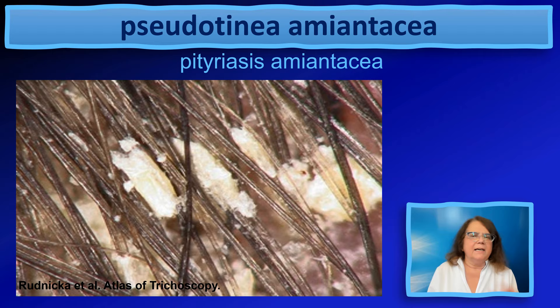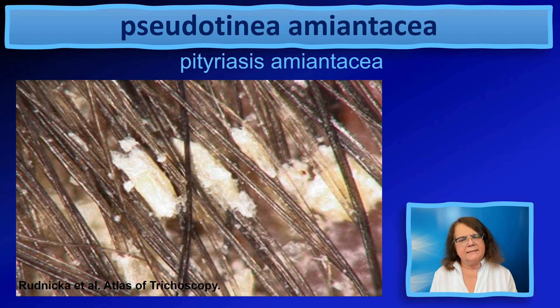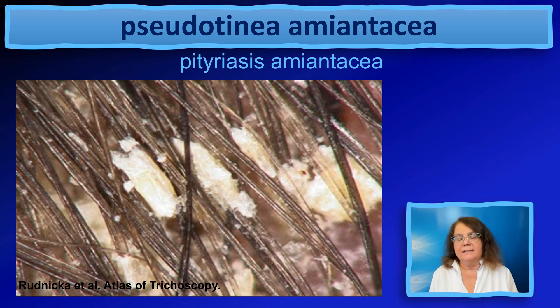Pseudotinia amiantacea may be a manifestation of many diseases, including psoriasis. Here you see the typical trichoscopy image of pseudotinia amiantacea with the typical multiple hair casts. Again, just to repeat: this is not typical of psoriasis — it may be present in any disease which has this clinical manifestation.